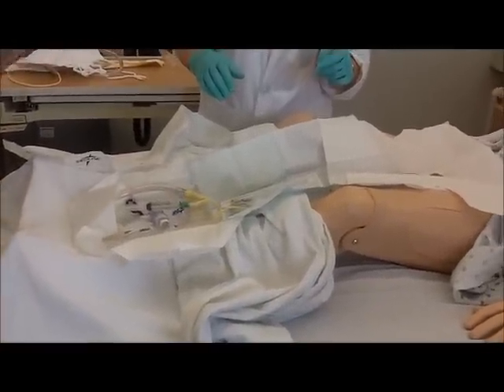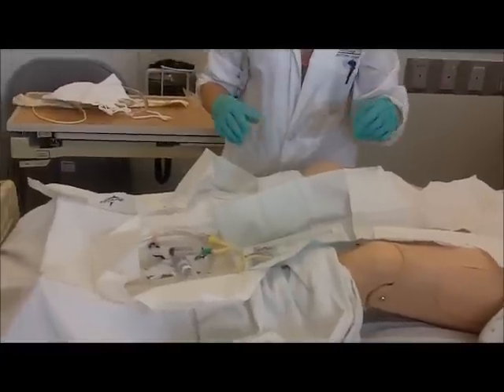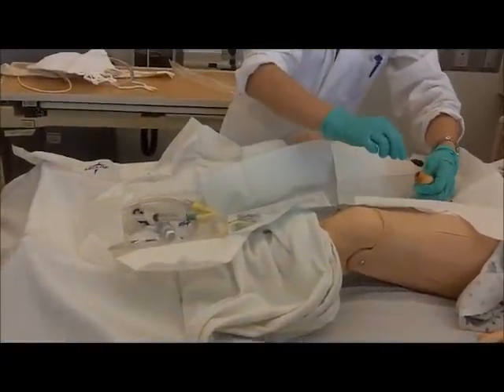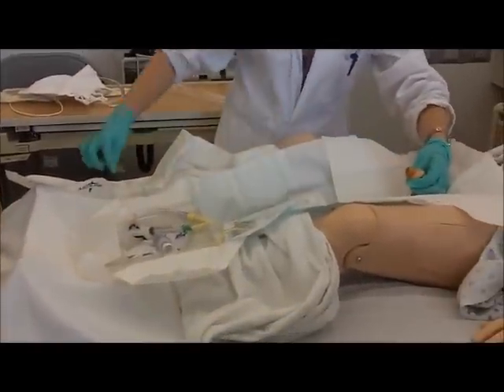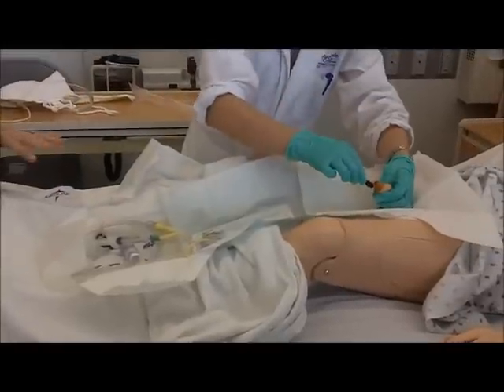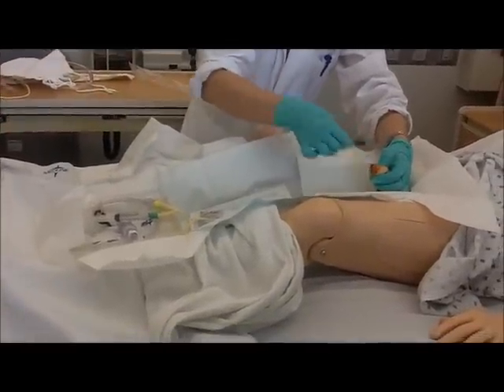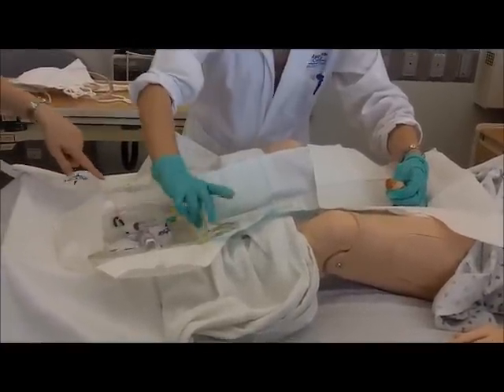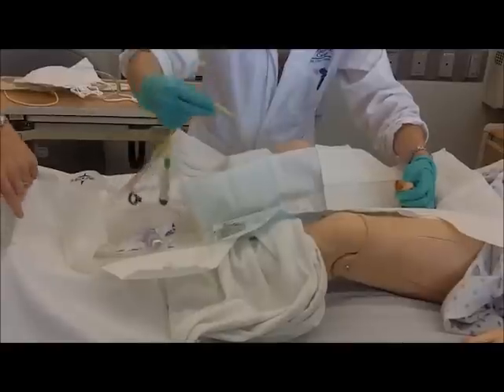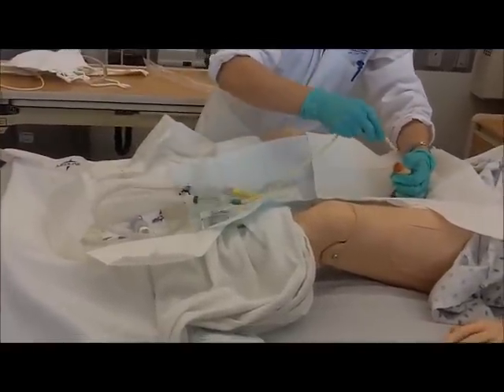And then sometimes you have to work fast because they start kicking their feet and start moving around. So it's like boom, boom, boom — it's in. I'm cleaning three times with povidone iodine. One, two. And I normally don't throw in here just so I don't contaminate. But if you've been working years in the hospital and you know you're going to throw here and you're not going to touch that, it's okay. After that I'm taking my catheter — it's already lubricated — and then just go in there.